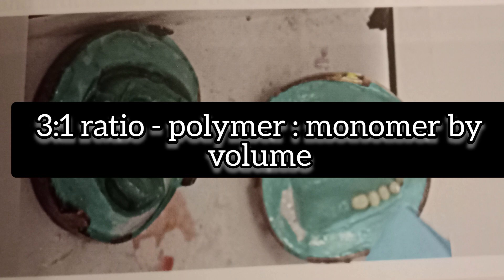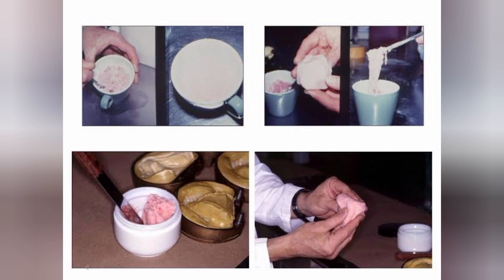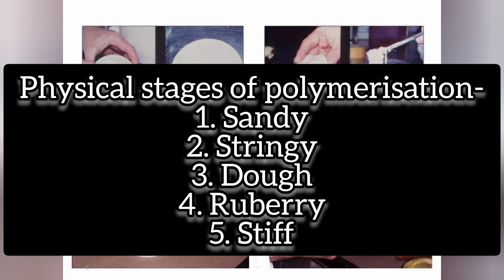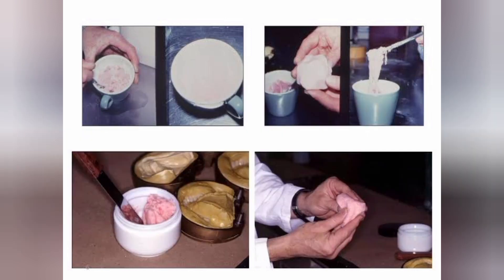So we take three parts polymer and one part monomer, dispensed in a porcelain jar. The jar is closed tightly to prevent vaporization of monomer. The material is then packed into the mold space in the dough stage. Remember the physical stages of polymerization: sandy, stringy, dough, rubbery, and stiff. When the mix reaches the dough stage, we pack it.